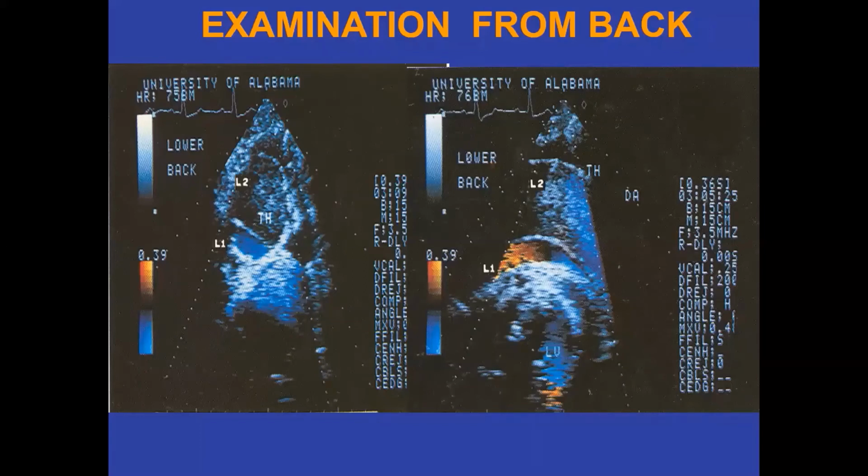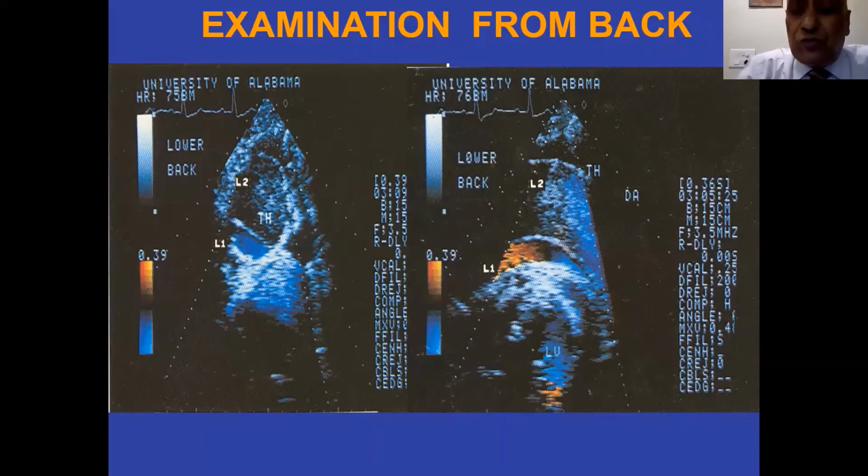Yeah, please. Parasternal short axis view should be seen from which intercostal space? So parasternal short axis view is always seen about the fourth intercostal space or so. Sometimes, these patients are built differently. So sometimes you might get it from the fifth, or sometimes from the third, but most of the time you'll get it from the fourth intercostal position.